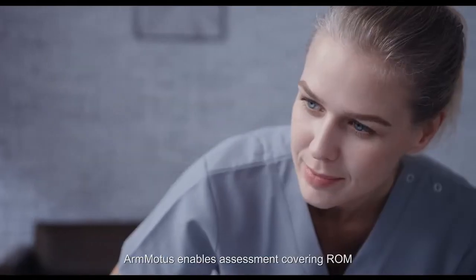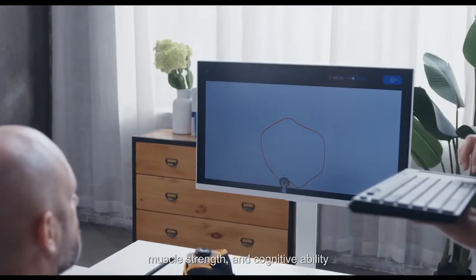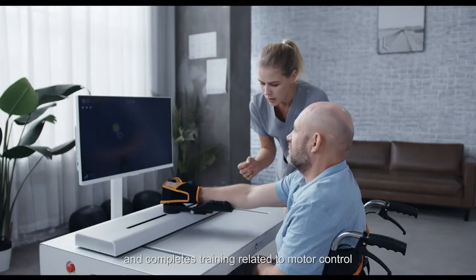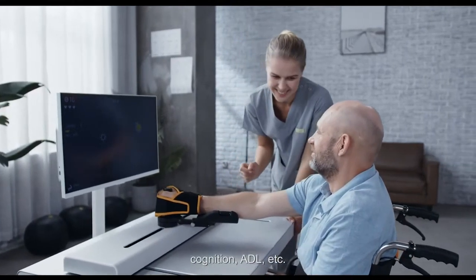ArmModus enables assessment covering range of motion, muscle strength, and cognitive ability. Based on assessment results, it recommends training parameters and completes training related to motor control, cognition, ADL, and more.